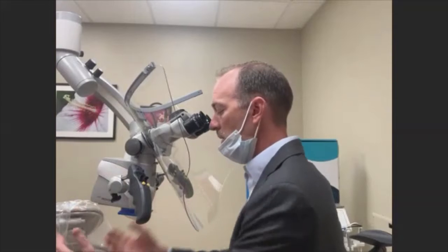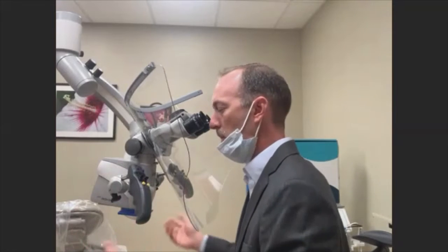Well, nothing worse than splashback when you're in the dental chair, especially during a pandemic. But now a graduate of the OSU Dental School has invented something that keeps patients and practitioners safe and dry. Here's Caroline Cohen. And it allows me to still freely move, get instruments passed to me.